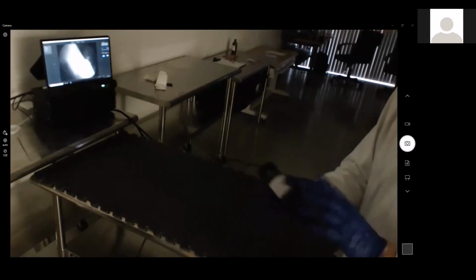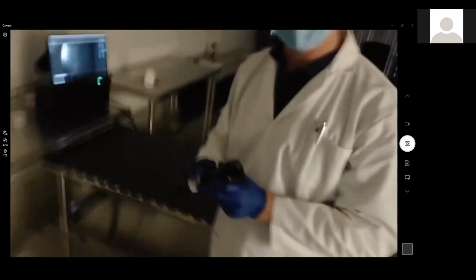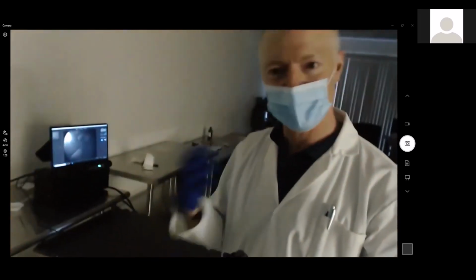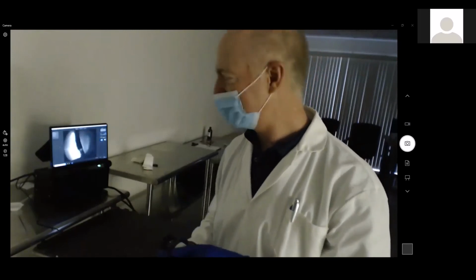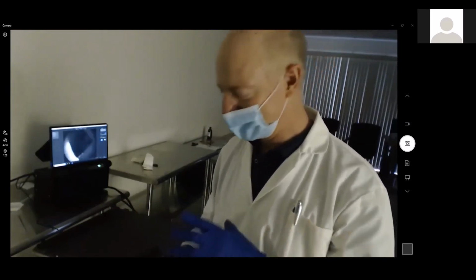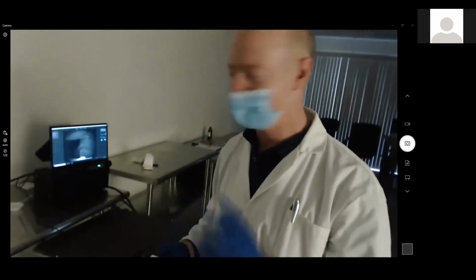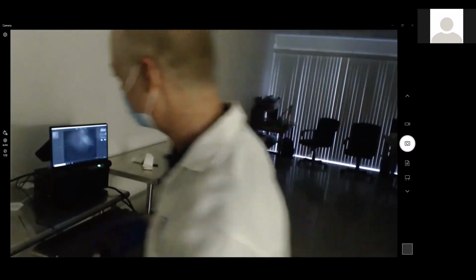So that's one of the reasons we were kind of playing with this. Wanted to give an example. You can see some of the positives and negatives and some of the implications around fundoscopy. That's kind of why I wanted to bring this into the equation. I'm sure in the not too far off future, some of these features and functionality we're going to be doing some other things with, so stay tuned on that as well.